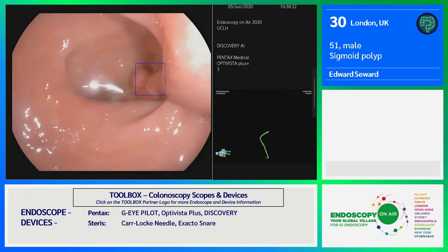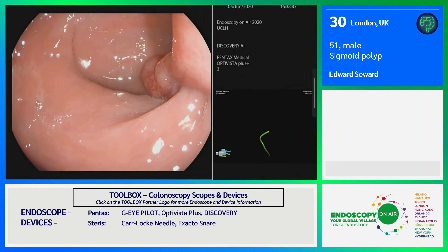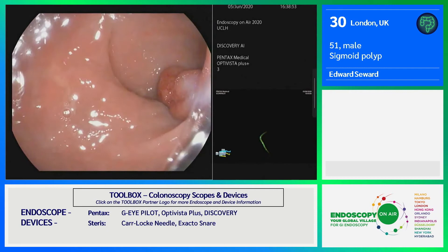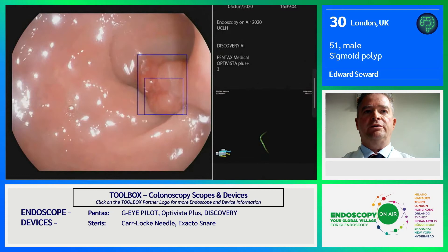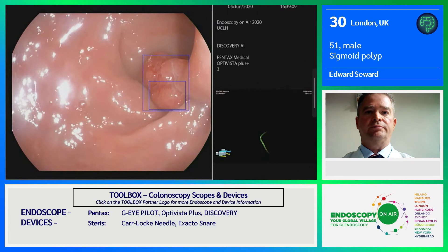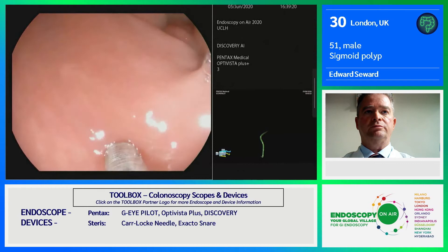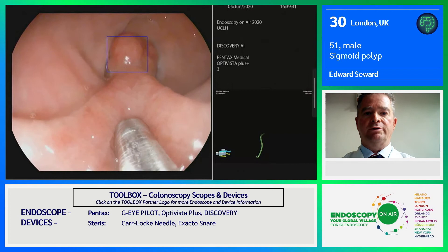So this is a fairly obvious polyp that I don't think you'd struggle to spot. The stalk's not that long, so I probably won't pre-clip here. If you've got a really nice long stalk, you can pre-clip a pedunculated polyp — essentially just put a clip on the base, and that guarantees that the polyp removal is fairly bloodless. My concern with that is not having enough space to complete the resection safely. So I'm going to do the slightly more tried and tested method of injecting first and then getting a snare around. Putting the polyp into the six o'clock position helps with stability — that's a perfect position.